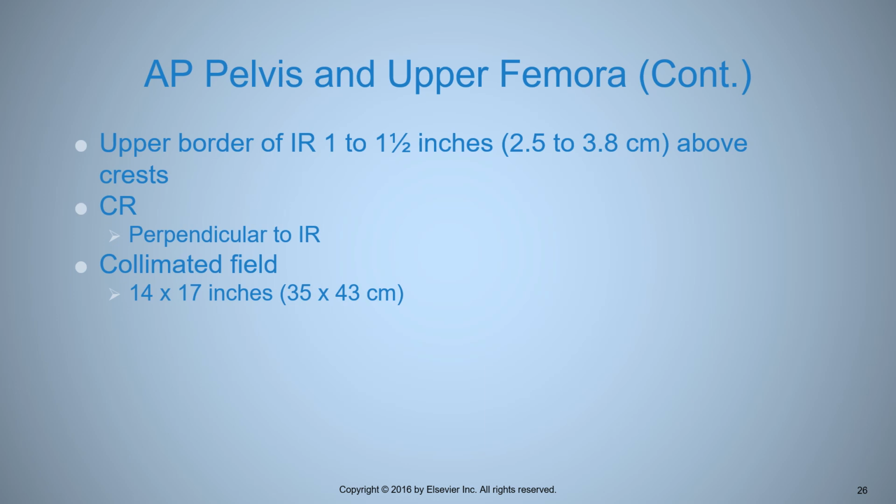Okay, and so obviously in a trauma situation, you're going to be getting the image receptor physically under the patient, hopefully using a flat sheet in between, the flat sheet and the stretcher mattress. And you're just going to have to shimmy and then kind of poke, right? Poke for the iliac crest and then knife down from that point. With your fingers, do you feel the image receptor underneath your fingers when you're knifing straight down at the level of the iliac crest? Okay, I think I taught that to this group when I talked about a trauma flat plate chest X-ray, the knifing down technique.